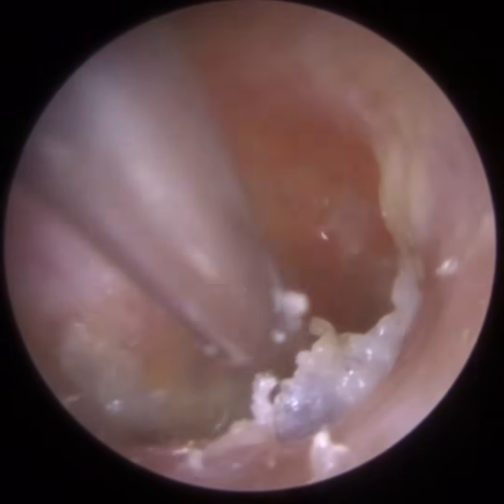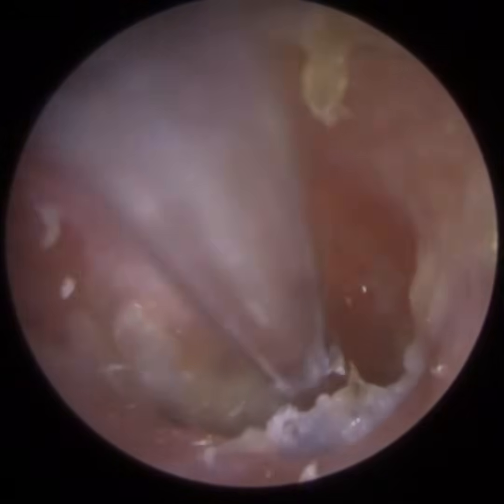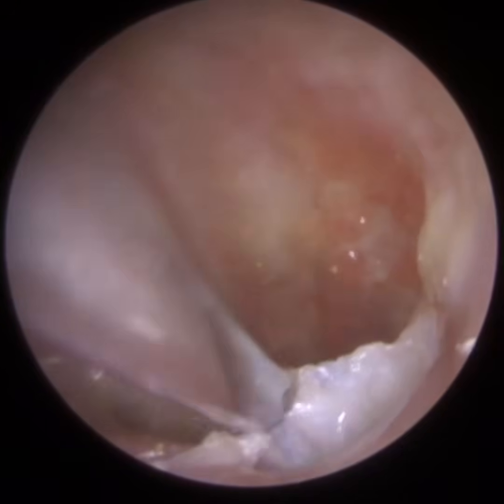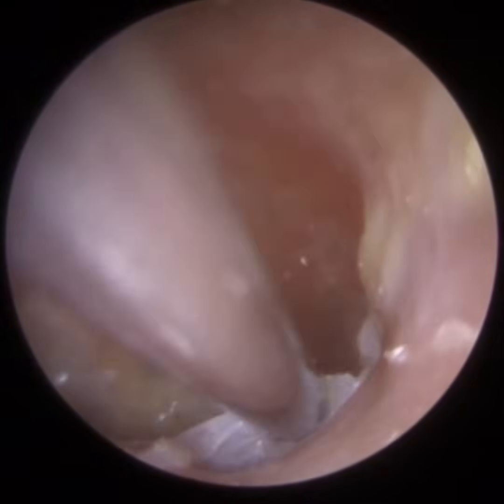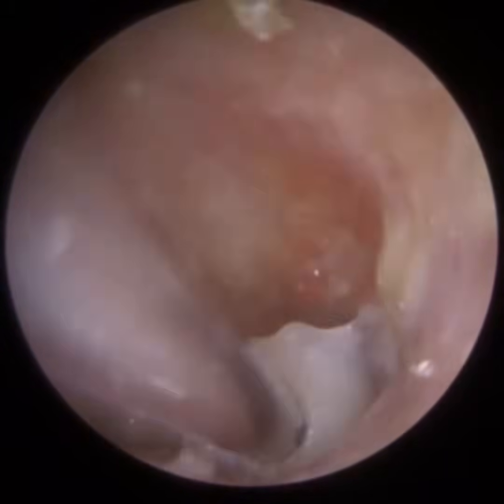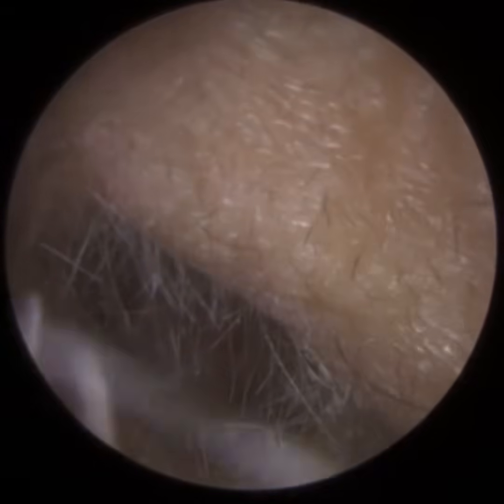It's one thing getting access, but then it's another thing removing it. We have to manoeuvre the suction probe to loosen up the canal wall. And again, it's so difficult here in the inferior recess, and there's limited space. The patient has got quite a narrow ear canal. Unless we manage to peel this upwards. There we are. And I bet you weren't expecting that when I was peeling it slowly away. Neither was I.